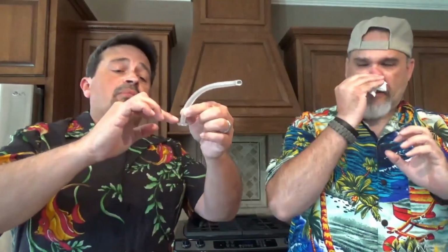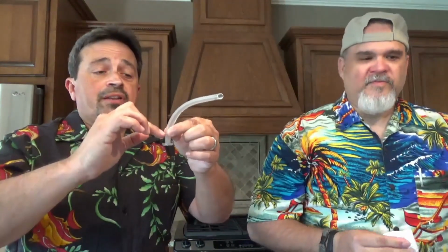So the distance that it went in, it had already made the turn. I know you can't, unfortunately, look at that, so let's go sideways. It had already made the turn, and it was down there right at probably around his uvula, or just about to be behind the tongue where you want it to be placed eventually, and that's what was triggering his gag reflex.